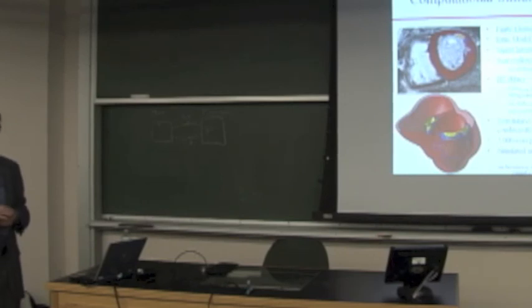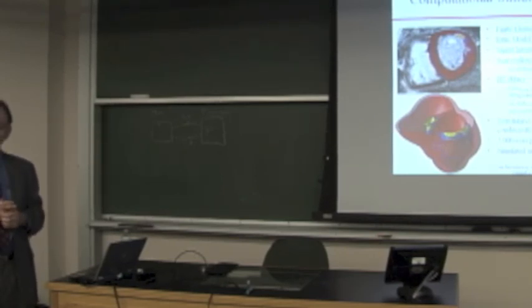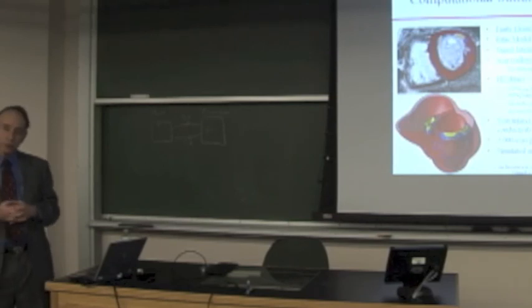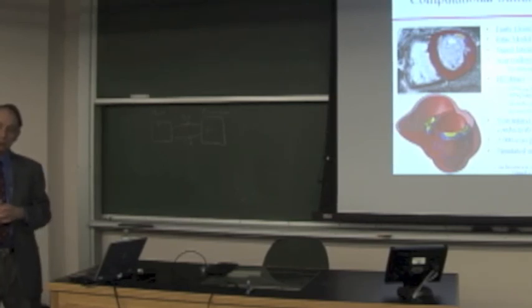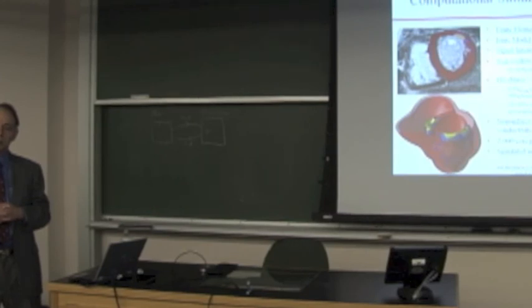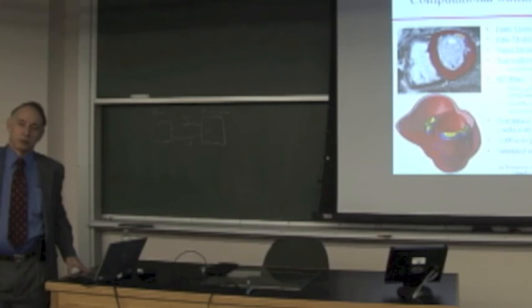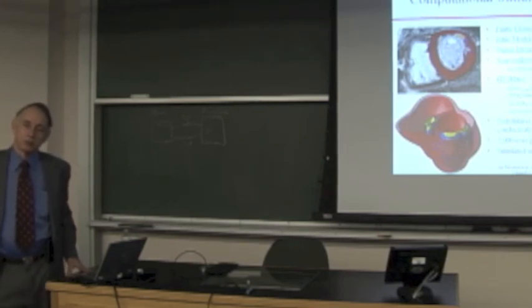Yeah. So some of the non-ischemic cardiomyopathy MRI images that you display don't reflect this, but often in non-ischemic cardiomyopathy there are multiple areas of gray zone. So to actually use this as a template for ablation would be very difficult. And even in some of the images that you showed, there are other areas of gray zone that did not figure in even the computer modeling. Right.